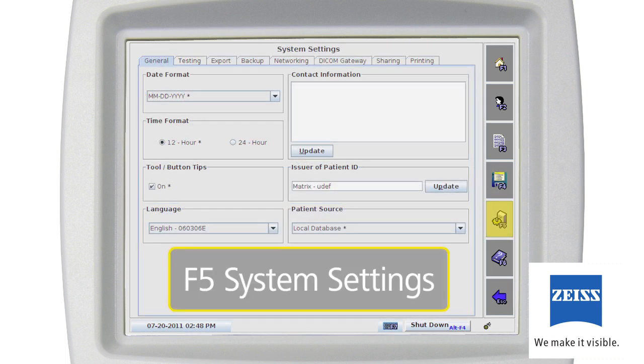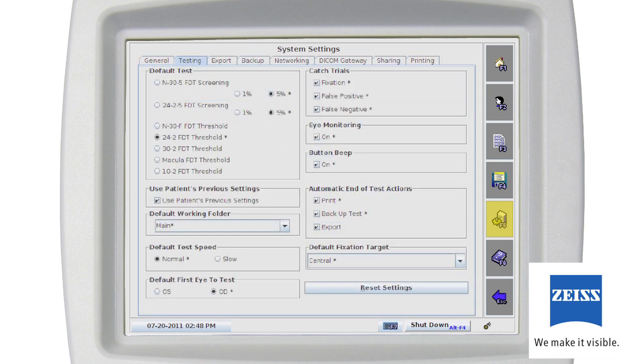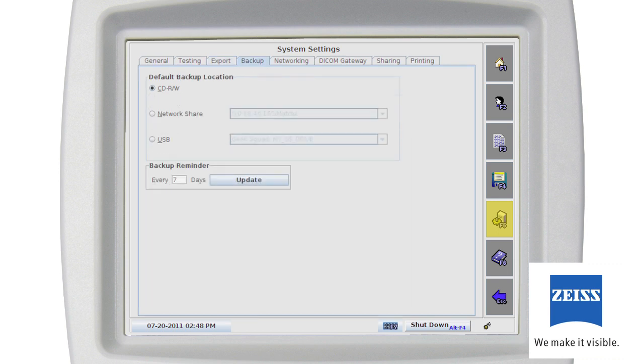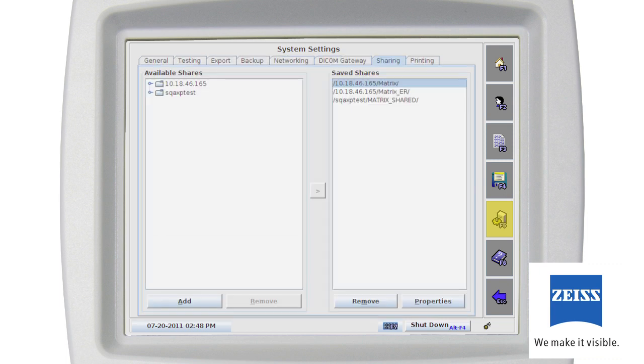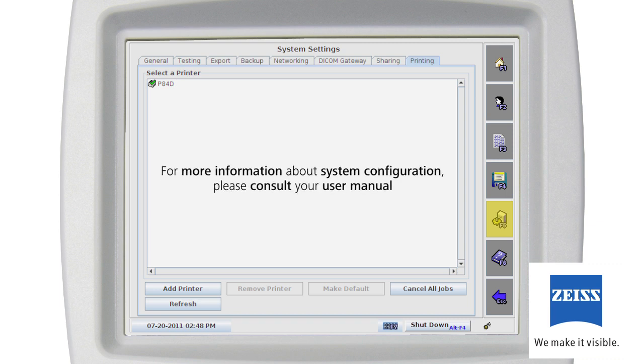The System Settings screen, F5, provides the operator with the ability to customize the configuration of the Humphrey Matrix visual field instrument by changing default system settings to meet your preferences and practice needs. The System Settings screen is comprised of eight screens: General, Testing, Export, Backup, Networking, DICOM Gateway, Sharing, and Printing. For more information about system configuration, please consult your user manual.